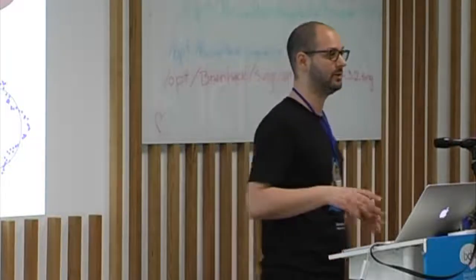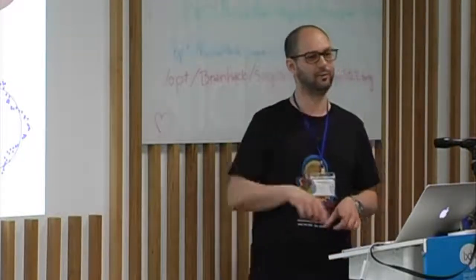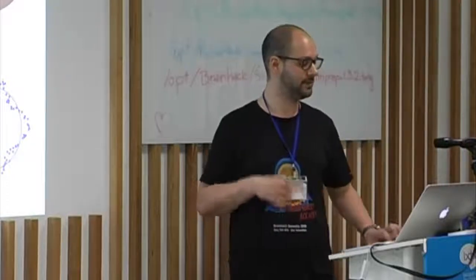Let's now complicate the scenario a little bit more. Let's consider a different voxel in which you have two fiber crossings at, let's say, exactly 90 degrees, on a plane.